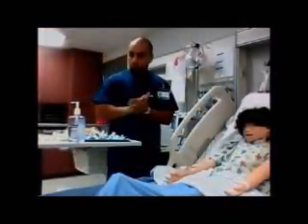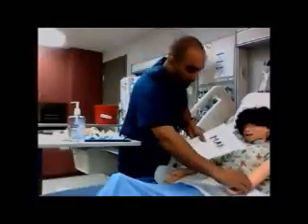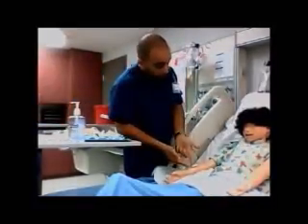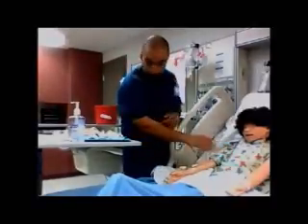The RN enters the room and performs hand hygiene. He identifies the patient using 2 patient identifiers, explains the purpose of the medication, side effects, and that the medication will be administered through the existing saline lock.